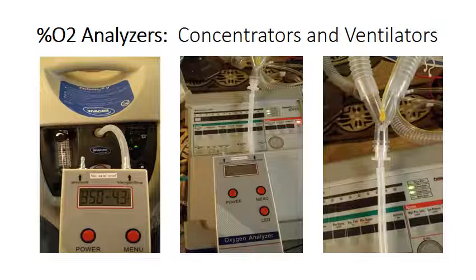Now, I've shown the configuration here of how the tubing is interconnected to the patient circuit, and that patient circuit has a standard connection to the ventilator. We will discuss later what the ventilator settings should be to, for instance, achieve an oxygen mixture of 40%, 60%, 26%, whatever.